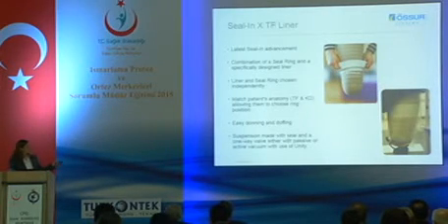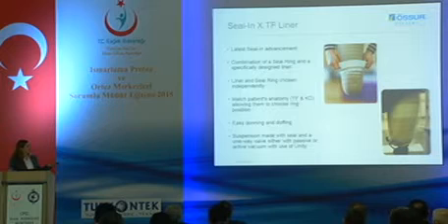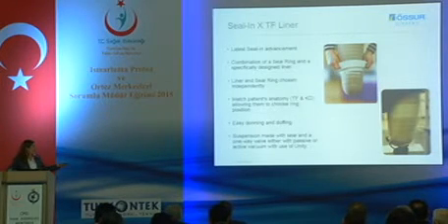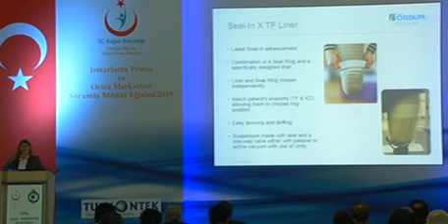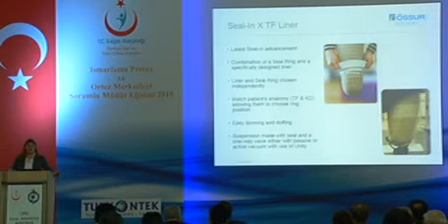We would use the sealant always with a one-way valve, whether it's a passive one-way valve or in fact using it with active vacuum with Unity, where you would have a tube and a vacuum bypass on the valve that would suck out all the air, providing a negative pressure within the socket.